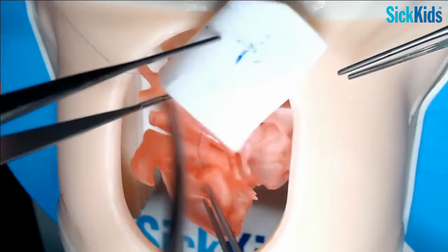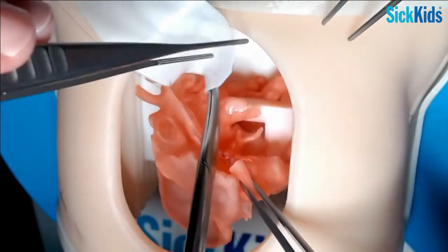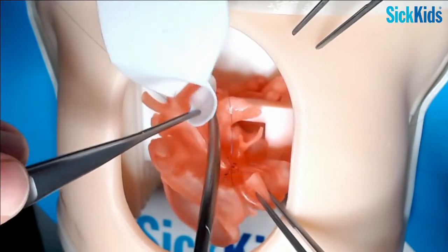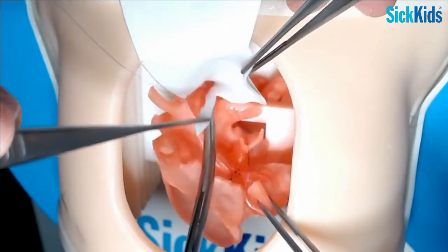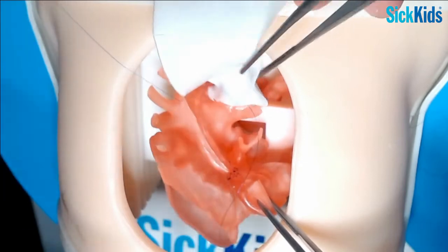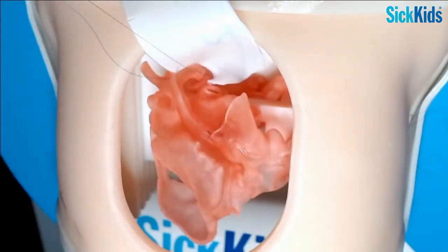Now let's work on the other side a little bit. We said that's going to be too wide. It is a little bit too wide, so I'm just going to take some of that out right now so we don't get in trouble from it being too wide. And let's swap sutures.